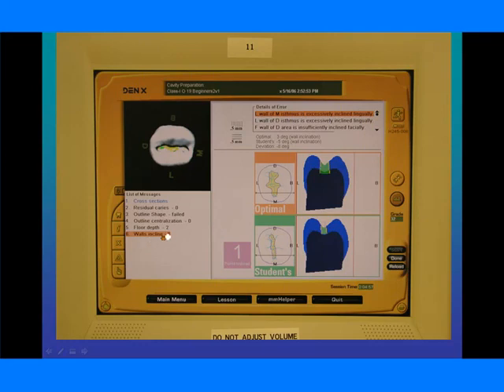Okay, now we're into wall inclines. This gives me a list of detailed errors up here of the wall angulations. Now if I have a problem with the wall angulation being off, then again I'm going to have an error up here to describe where the discrepancy is, and I can go back and fix it. Again, you'll notice that I've had 1 point reduced for this particular error. So every time you click on an error, you can look down here to see how many points have been reduced and how many you might be able to get back.